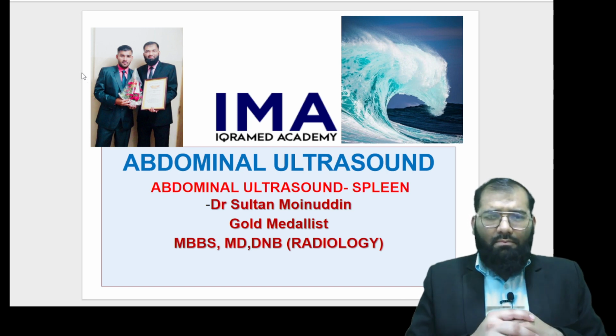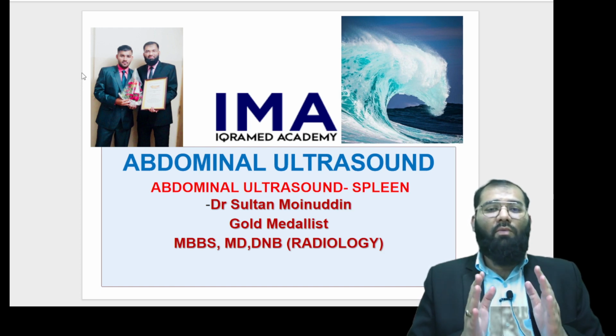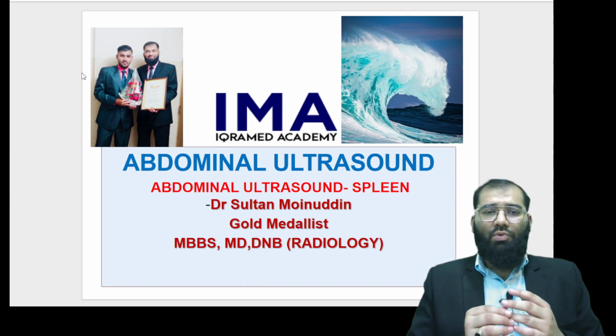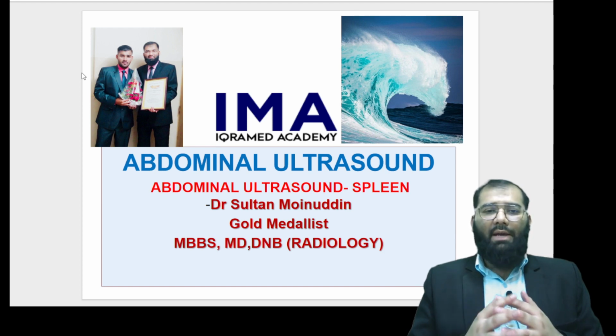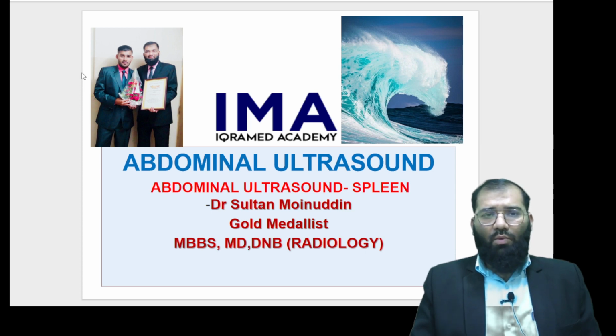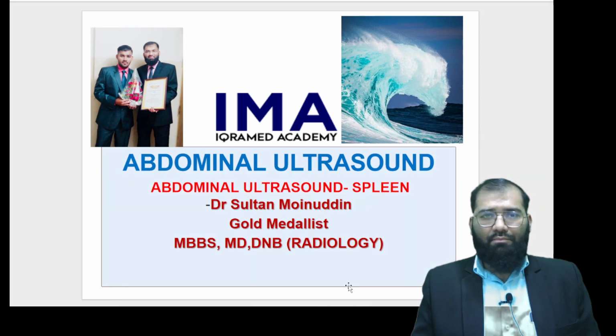This small lecture is based on indications where you would specifically look for spleen. Number one. Number two, I would talk about what are the various known splenic pathologies which can be diagnosed on ultrasound. So this would be based on this concept. So let us begin with this.